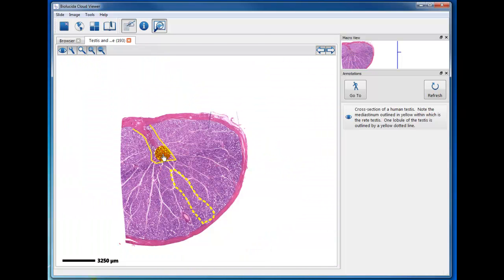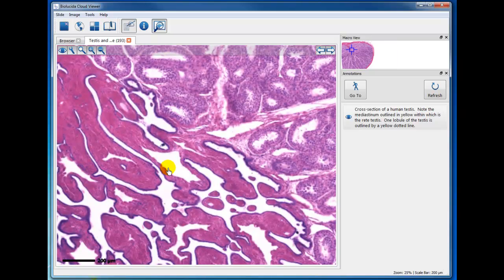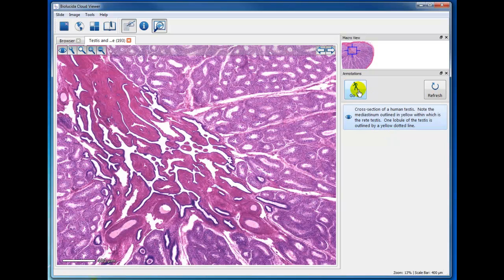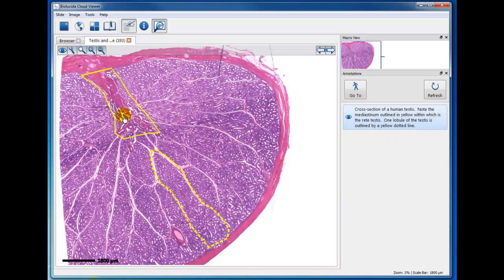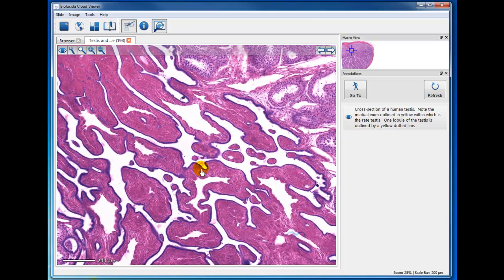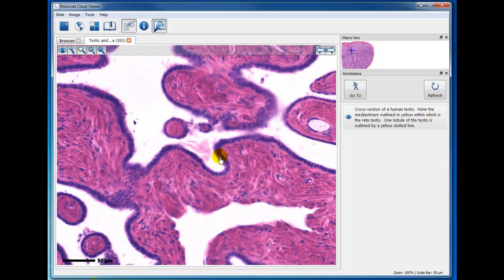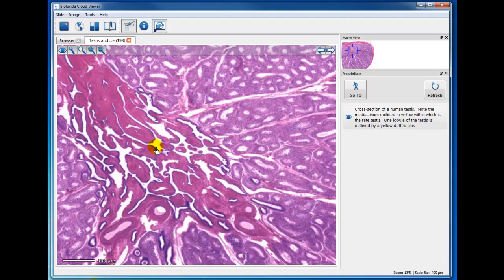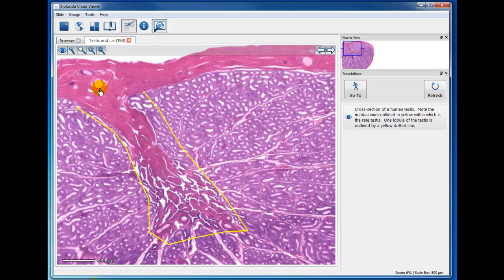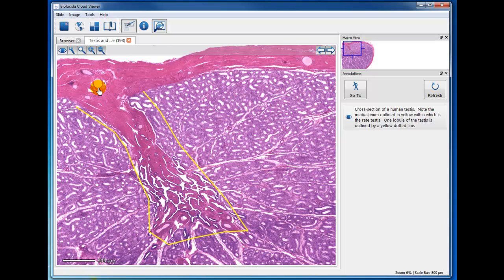And then if you go back down to the lower magnification, you will see the rete testes here. And in another specimen, we're going to show you more details of this. But these rete testes are all lined with epithelial cells that are cuboidal in shape, with some muscle between, and then the outflow of that, coming into it are straight tubules, and the outflow goes into the epididymis.